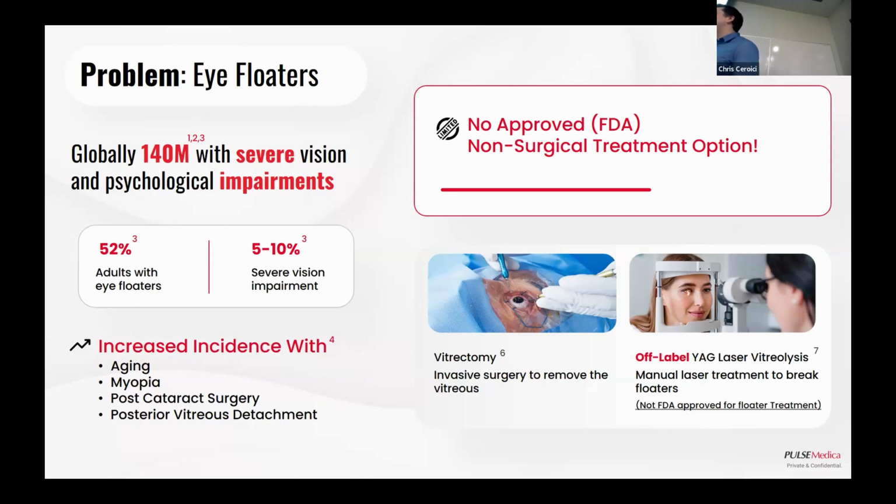So PulseMedica's goal is to come up with a non-invasive way to treat eye floaters, as well as build a system to diagnose and characterize floaters, so that we can come up with some measurement terms and characterizations that we can assign to different kinds of floaters.